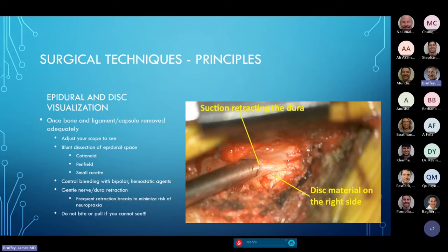Meticulous hemostasis is critical — bipolar cautery, hemostatic agents, flowable hemostatic agents — controlling bleeding in the epidural space when decompressing and removing disc or synovial cysts is essential for good visualization. In synovial cysts, these are often adherent to the dura, so you've got to be very careful. I will often leave a small remnant of synovial cyst capsule directly adherent to the dura, decompress laterally, superiorly, and inferiorly, and leave that medial cyst wall — it's probably not worth trying to peel it off when it's no longer compressive.